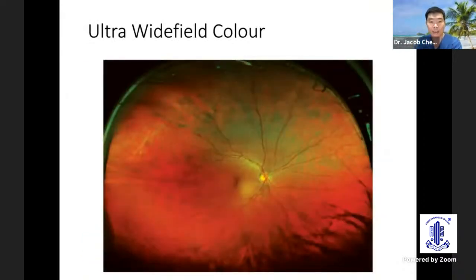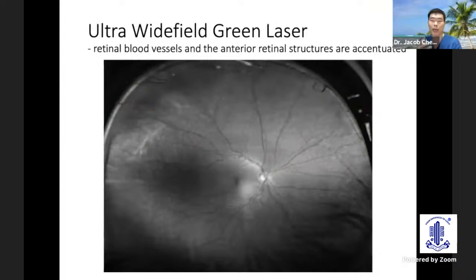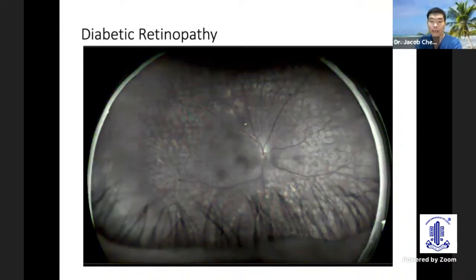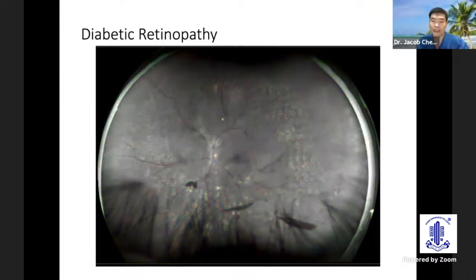Ultra wide field color, again, puts in the ultra wide field red laser, where we accentuate the choroidal blood vessels, but the green laser will highlight and emphasize the retinal and pre-retinal pathology better. Again, this is a patient you can see with pan-retinal photocoagulation. Applying the green laser, we can see where the lasers are, or areas of insufficient laser, for example, in the temporal quadrant. This patient also had laser done, but probably had some proliferative changes evidenced by the remnant of the vitreous hemorrhage.